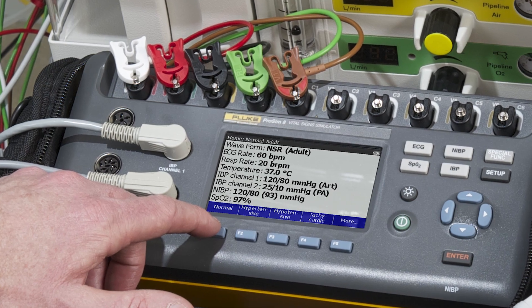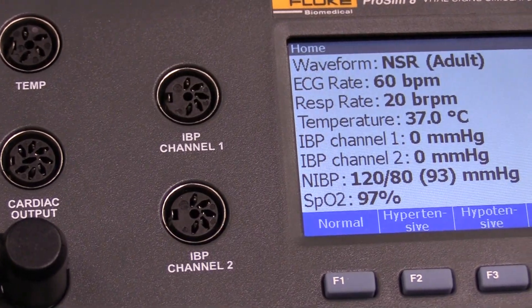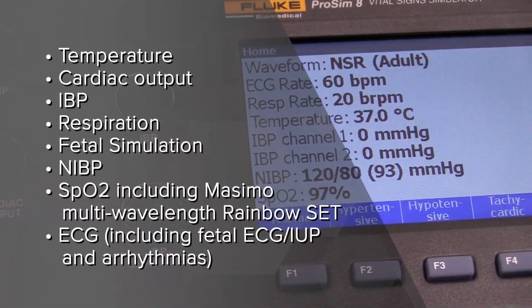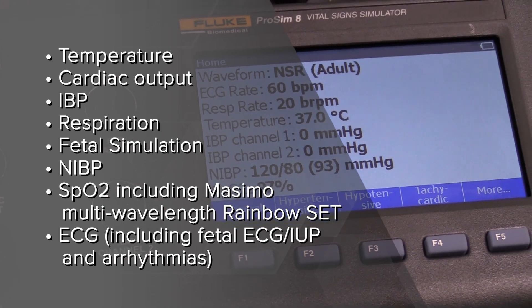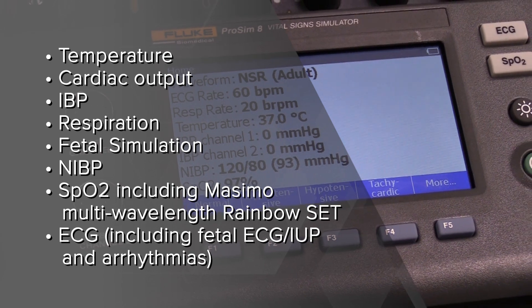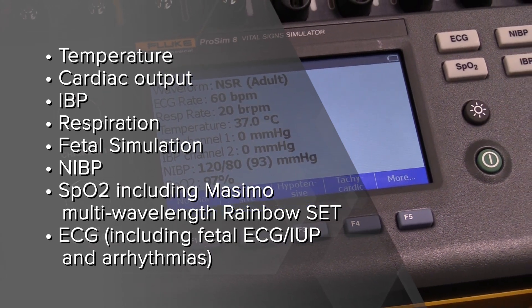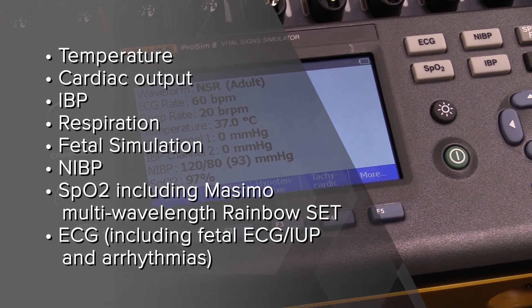The ProSim 8 can ensure the performance of the following patient monitoring parameters commonly found in preventative maintenance procedures: temperature, cardiac output, IBP, respiration, fetal simulation, NIBP, SPO2 using the ProSim Spot which can test Massimo Rainbow, ECG including fetal ECG, IUP, and arrhythmias.